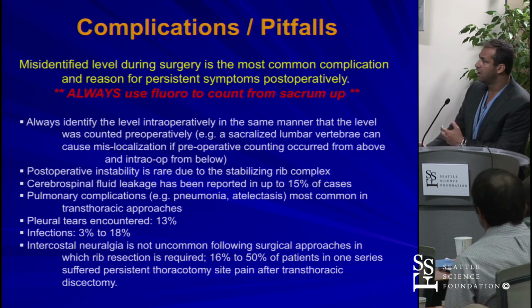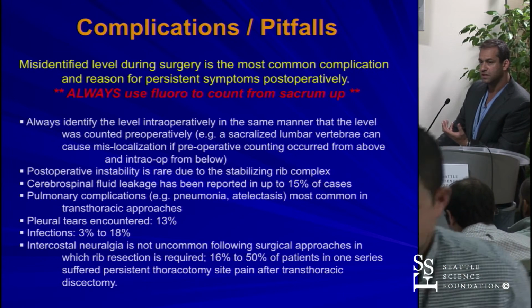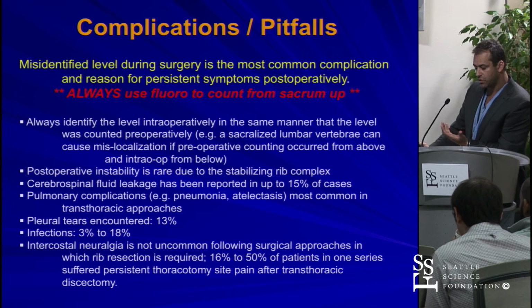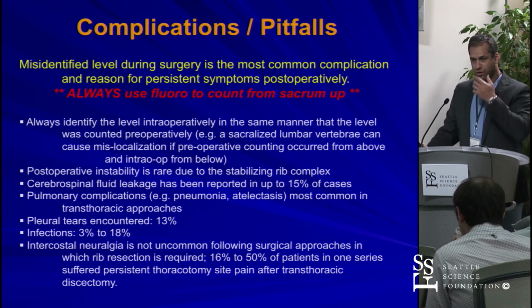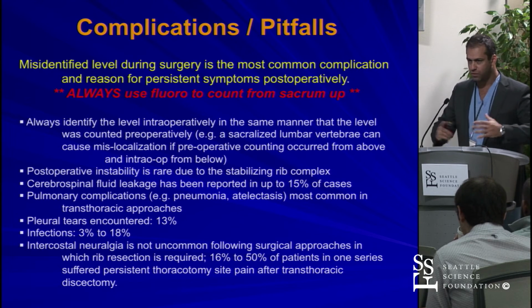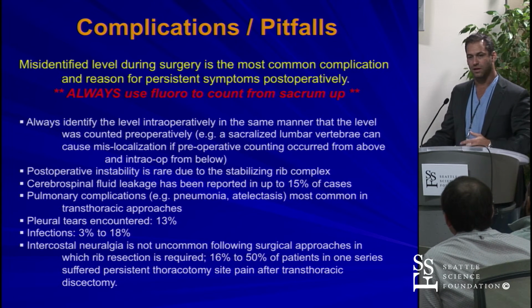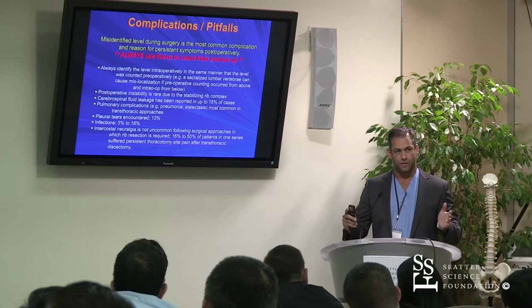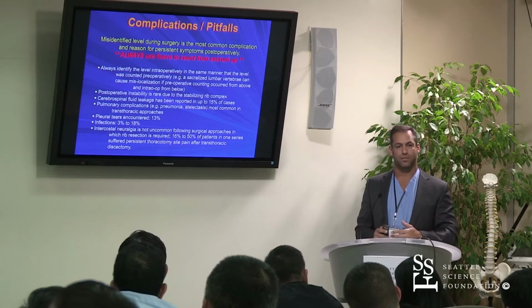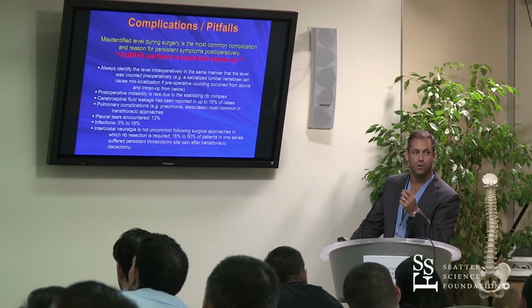And I'll go through the process myself, but one thing to keep of note is that when you're using these less invasive techniques, oftentimes you're cranking some form of device open, some retractor system open. And what you don't want to do, or what your initial impression is, is to give it a crank so you can get those ribs to open up as wide as possible. That's not the goal of minimally invasive surgery, right? The goal is to be open as much as you absolutely need to be. So I'll open it until I see the ribs move, at which point I'll release it one click, so that I'm taking some of the pressure off of that neurovascular bundle, and we'll talk more about that. But again, preparation, understanding, knowing what you're getting into.